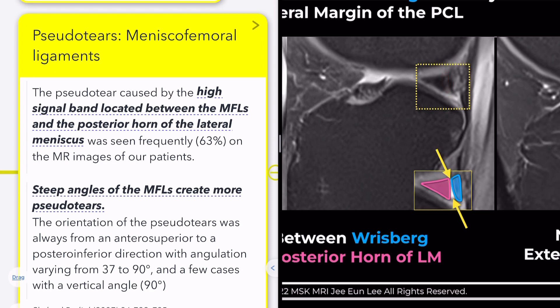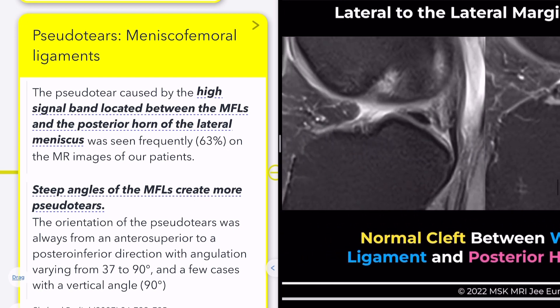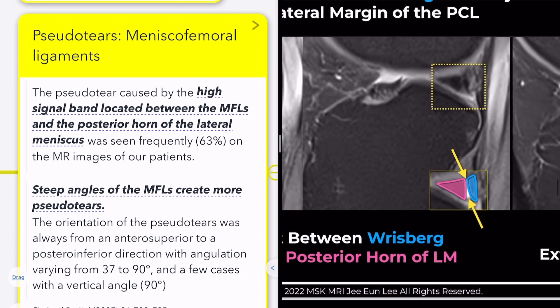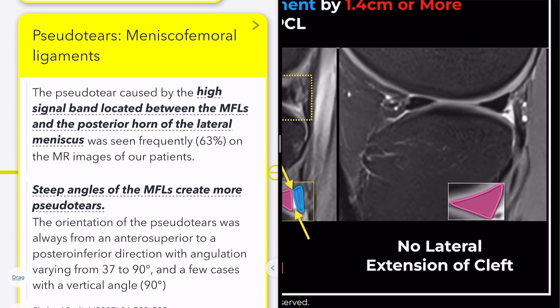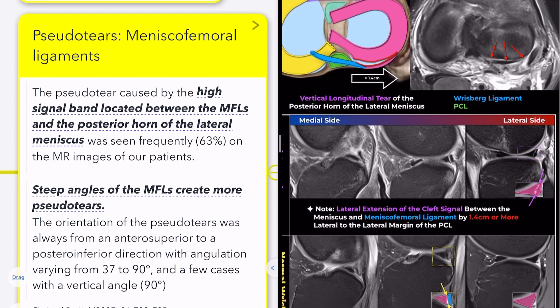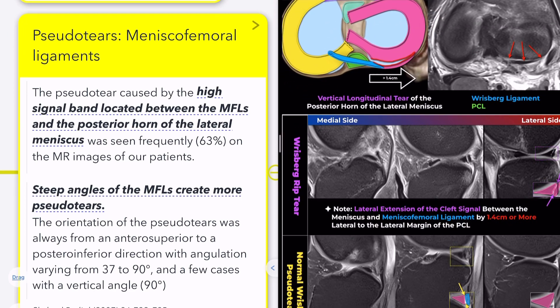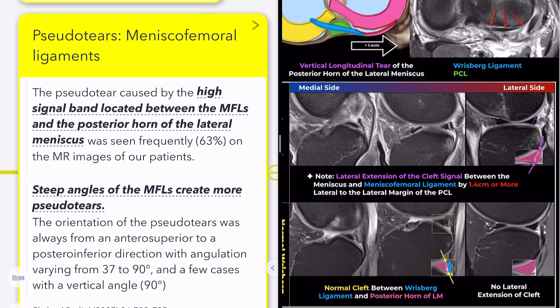To differentiate, a peripheral longitudinal tear of the lateral meniscus is more likely if the attachment of the meniscofemoral ligament extends 14 mm or more lateral to the posterior cruciate ligament. Additionally, if a longitudinal tear or cleft of the lateral meniscus's posterior horn extends to the fibular head's level, it is likely a Risberg rip tear.